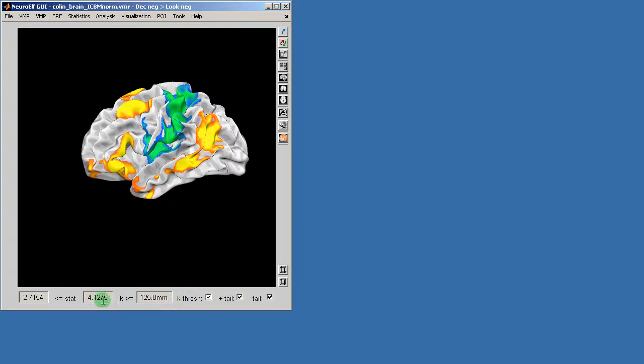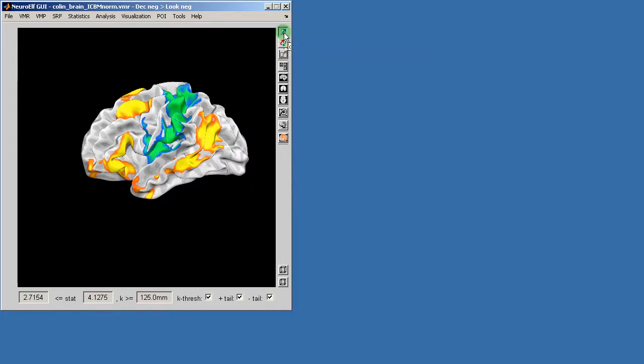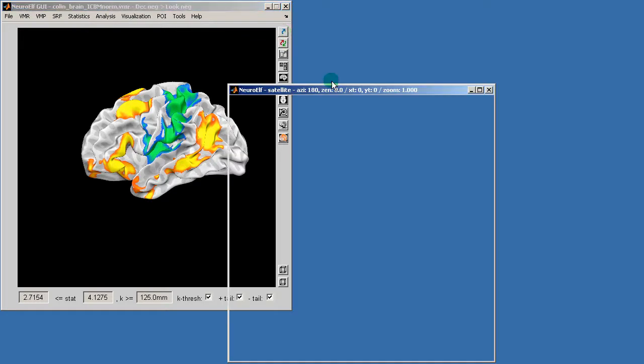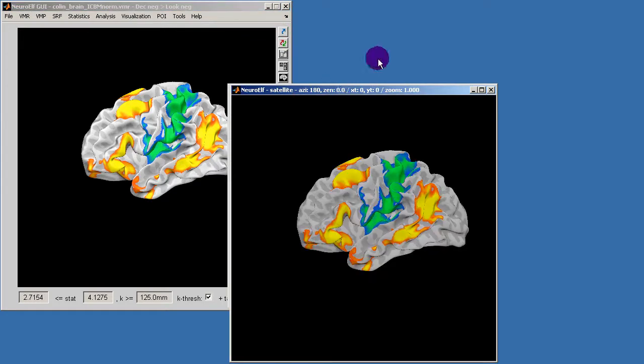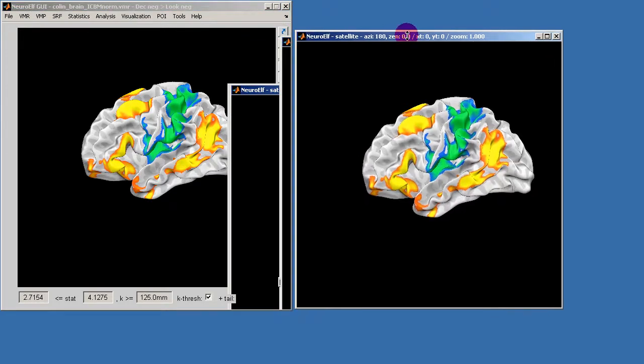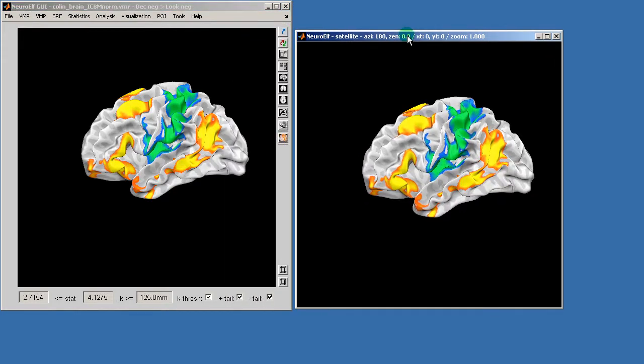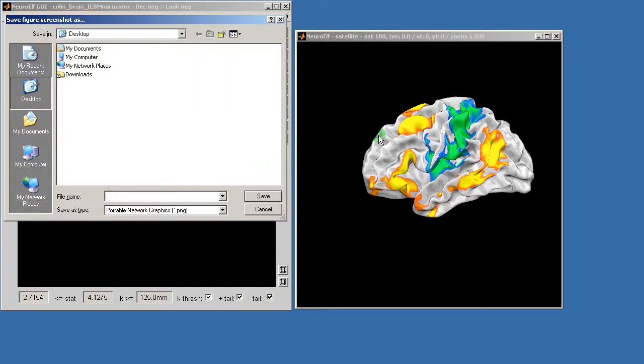And I will now undock this view by clicking on the undock button which will create a secondary view, and I will now hit shift S which allows me to save a screenshot.